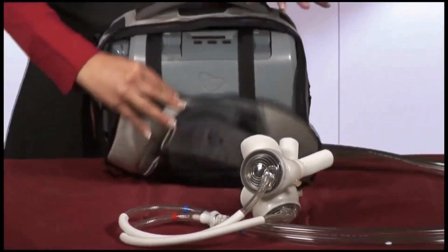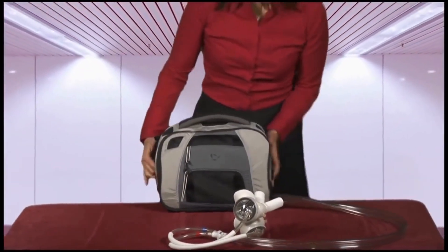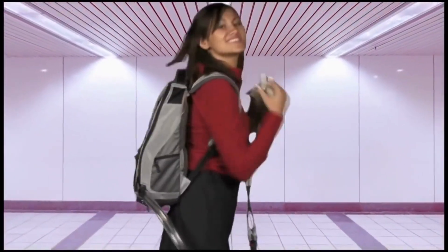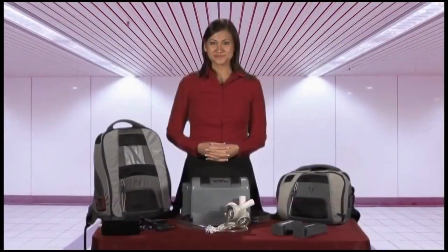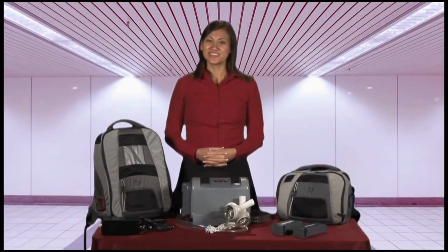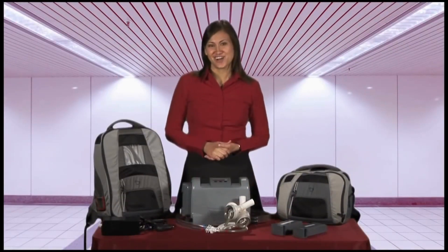The Freedom Driver is designed to be wearable. The patient has a choice to carry the driver in either a shoulder bag or in the Freedom Backpack. This video is only an introduction to the Freedom Driver system. If you have any questions, please contact your heart hospital.